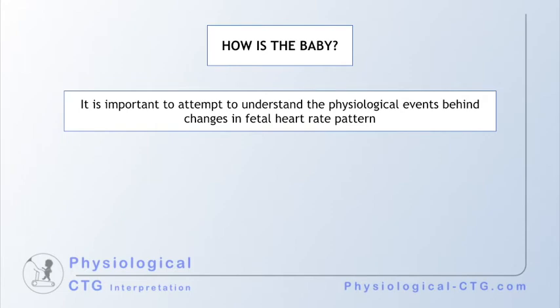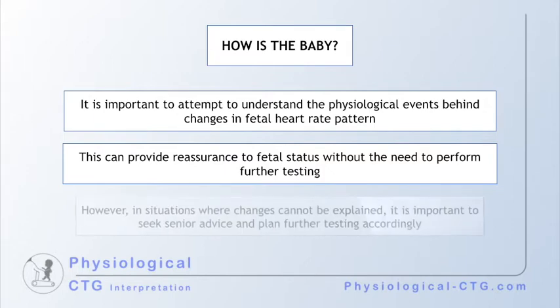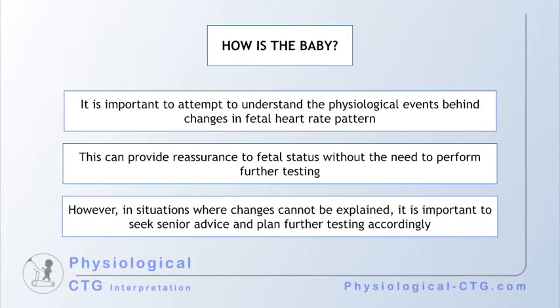It is therefore important to understand the physiological events behind the changes in fetal heart rate and recognise the signs of decompensation. An awareness of these features can provide reassurance to the fetal status without the need of performing further testing. However, in situations where changes cannot be explained, it is important to seek senior advice and plan further testing accordingly.